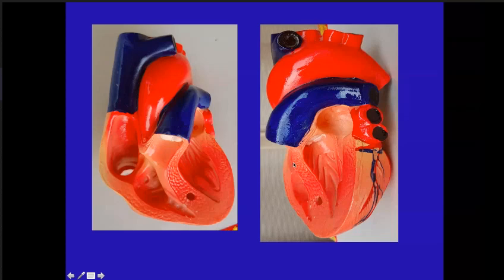Look at the septum. Normally, when we draw a diagram to explain to anybody, we just draw an RV, an LV, and then a straight line. This is the septum. But the actual septum is not a straight line. It's a very, very curved structure. It has curvature in two views. If you remember your echo in short axis, it forms a curve like this. Do you remember the curved septum in short axis view, like this?